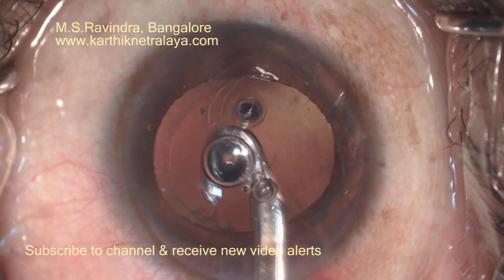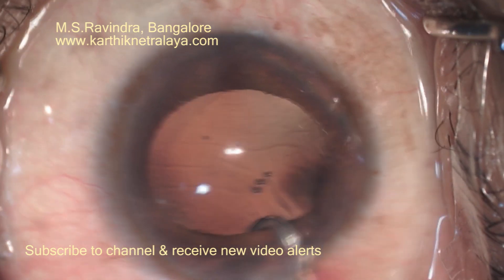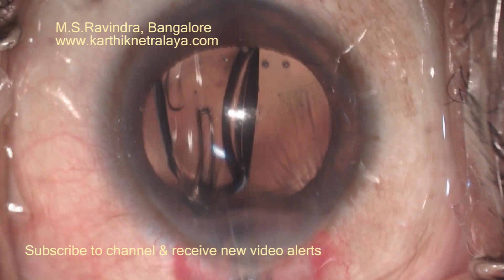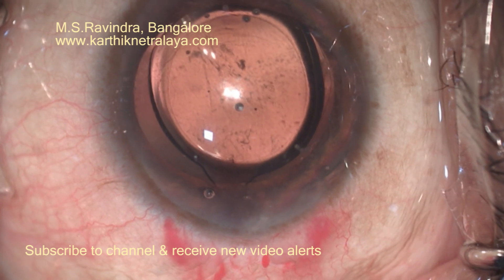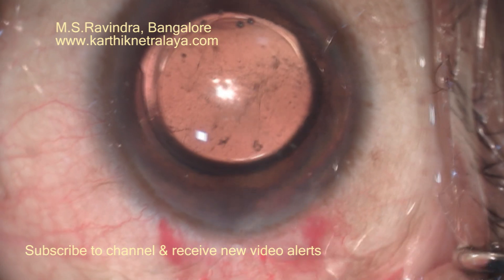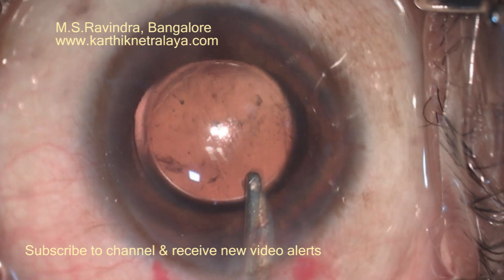Mature cataracts can be comfortably handled under topical anesthesia. Under special circumstances, the most critical step is protection of the endothelium when handling the nucleus in the anterior chamber — continuous infusion in front of the nucleus helps protect the endothelium maximally. Proper planning and execution will give you a good capsular rhexis, and you will be able to implant a multifocal toric lens even in a mature cataract.